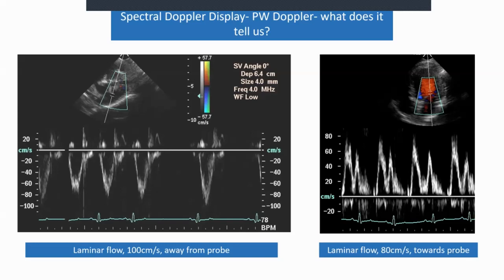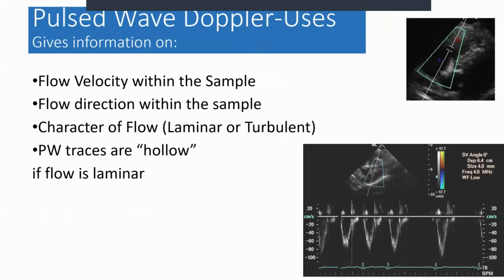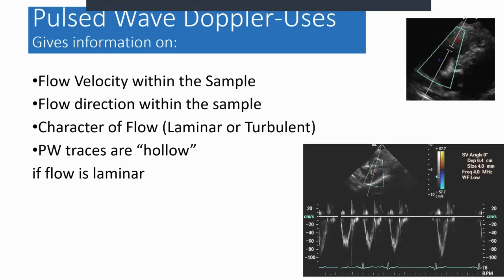This is mitral inflow from a left apical four chamber view — flow heading towards and through the mitral valve the right way, from left atrium to left ventricle, above the line at about 80 centimetres per second — that's the E wave — heading towards the probe and laminar. Pulse wave Doppler gives information on flow velocity within the sample, direction (above the line is towards, below is away), and the character of flow. If laminar, you get a hollow tracing; if turbulent, the whole tracing is filled in.